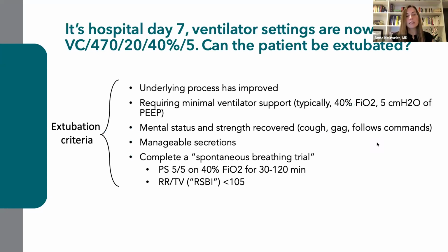So the criteria for extubation include, first, that the underlying process or the reason for intubation has improved. The second is that the patient is on minimal ventilatory support, typically 40% FiO2, 5 of PEEP. Their mental status and strength have recovered, manifested by a cough, a gag, ability to follow commands or raise their head. They should have manageable secretions.